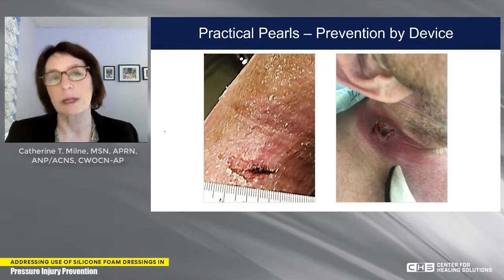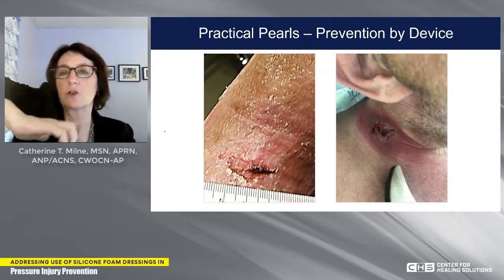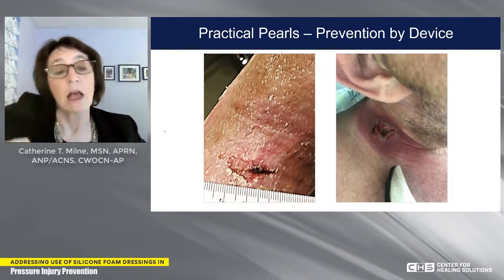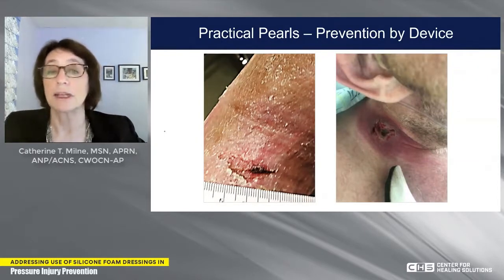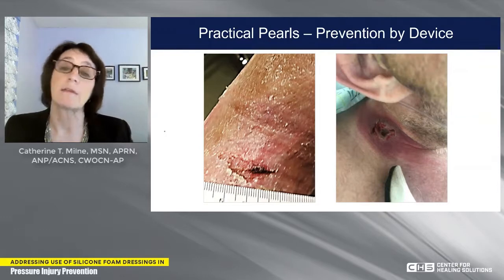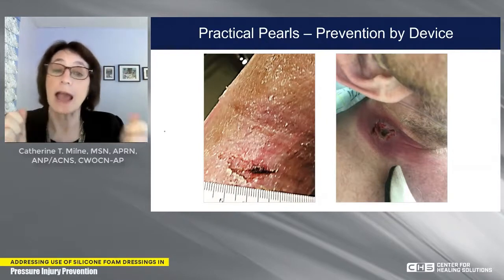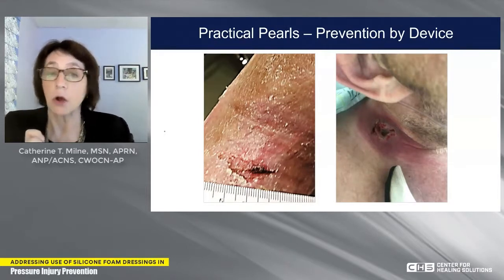The picture on the left is really a bad picture, and I apologize for this, but this is actually at the base of the dorsal foot, right where the tibia and the foot meet. There are a lot of people who are really rigid there and have no range. So when you have a wound on the heel or the toes, people wrap them up, and they usually like to use Conform because it looks nice, doesn't wrinkle, and is not as bulky. But if they have any underlying issues such as edema or peripheral vascular disease, when you stretch that conforming gauze out, it actually creates shear strength, and it will stretch the tissue over the tendons in that area and cause pressure ulcers.